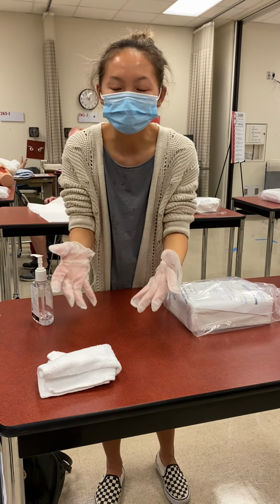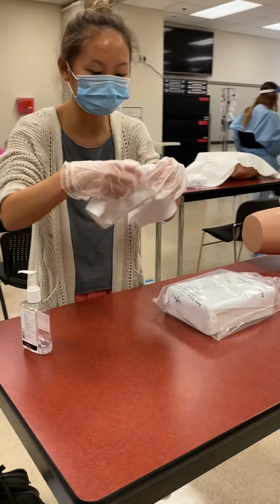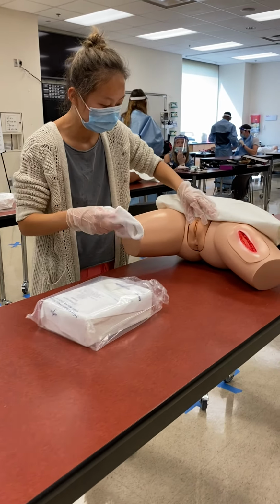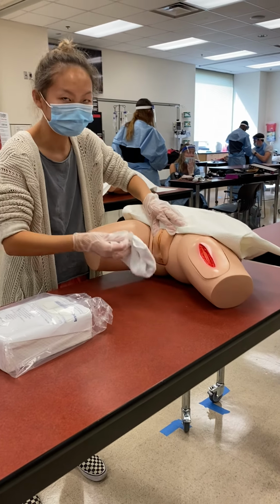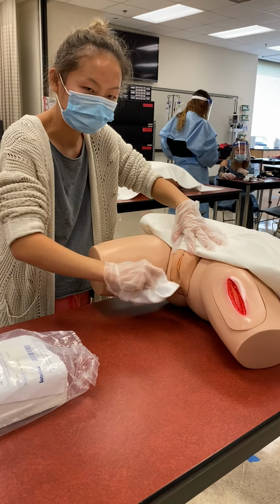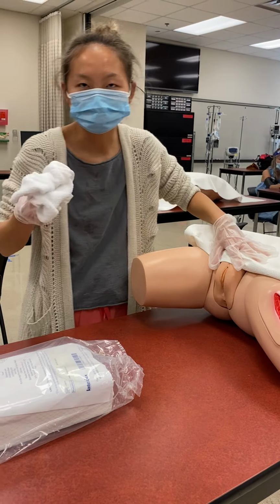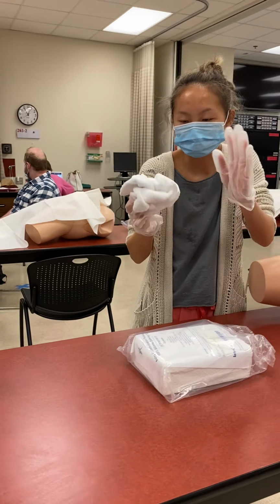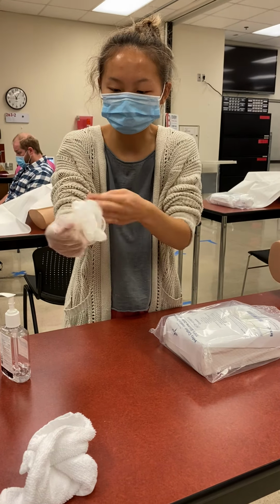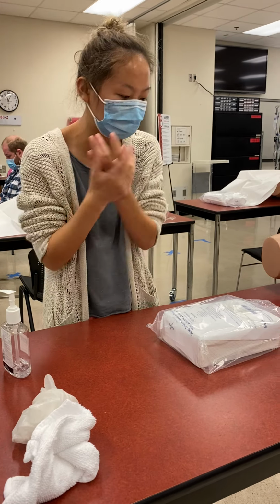And then I would get a water basin with lukewarm water, and then soap and a washcloth. And then we're going to go over and do our pericare. So I want to wipe on the outside, get a new clean side, wipe on the other side, and then our last side wiping in the middle. And I would discard this in the dirty linen bin and then throw these gloves away. So we're just going to put them in our dirty linen corner over here. And then I would do hand hygiene again and wash my hands.